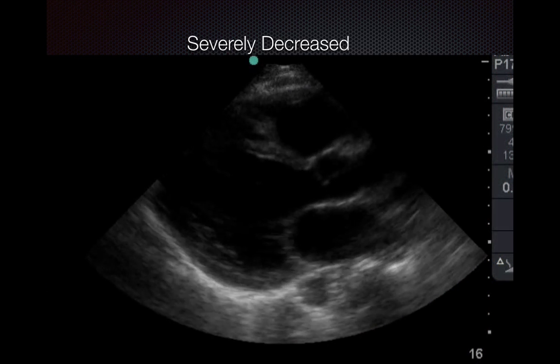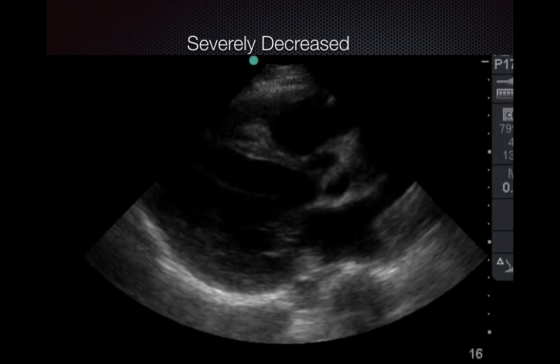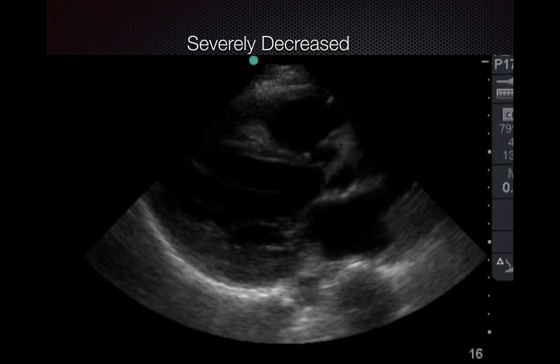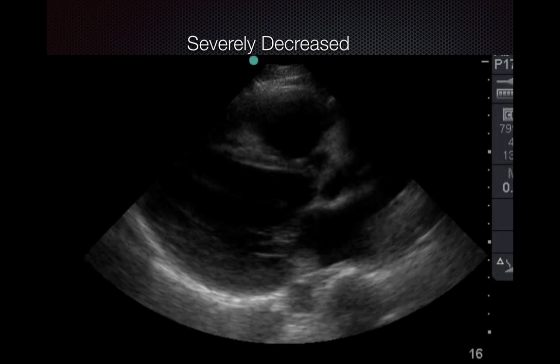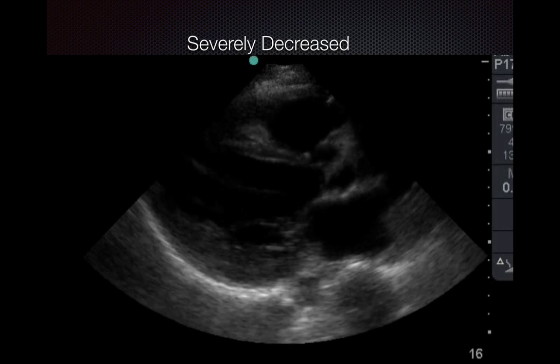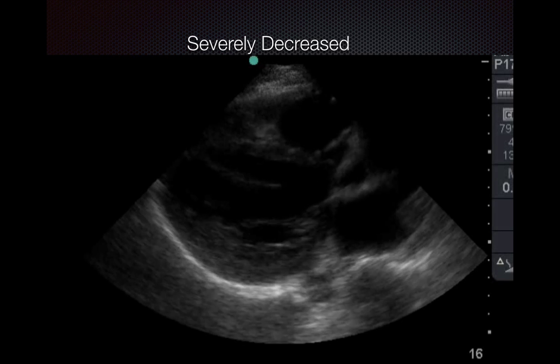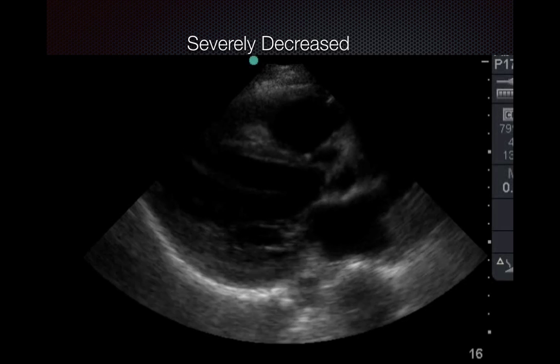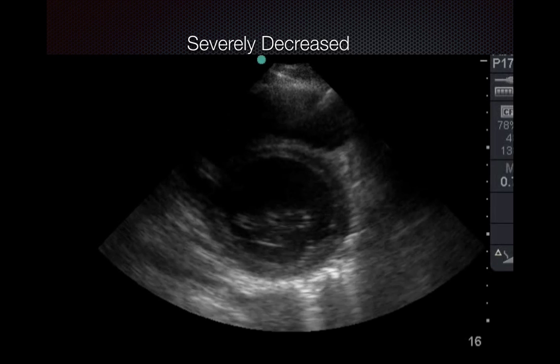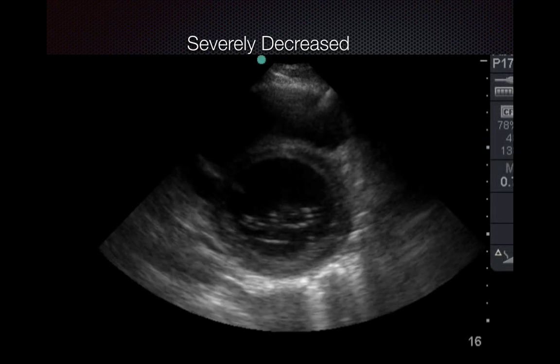This is an example of a heart with severely decreased EF. The myocardium just isn't moving very well and the mitral valve leaflet is nowhere close to the septum. Remember, the same patient at different phases in their resuscitation can have either normal, decreased, or severely decreased myocardial function — and that's one of the hallmarks of sepsis. So once you identify that somebody has sepsis and you know what their heart looks like, you may want to reconsider giving them two or three liters of normal saline right off the bat. Be a little more ginger with the fluids, and maybe add pressors a little early, because if myocardial function is down and perfusion is not great, they may need a little more beta agonist instead of just more fluid.